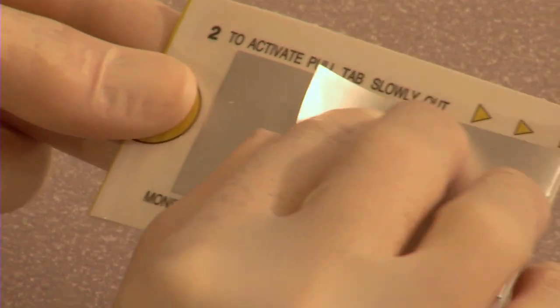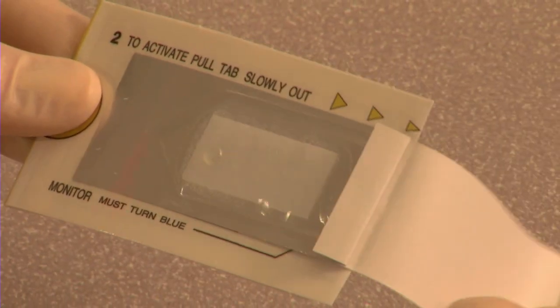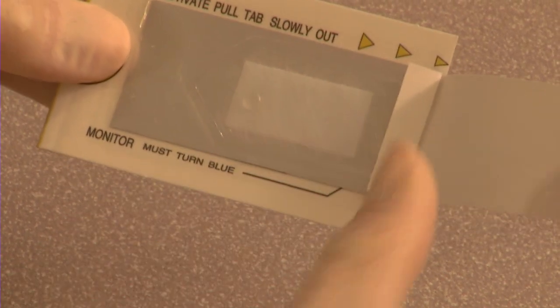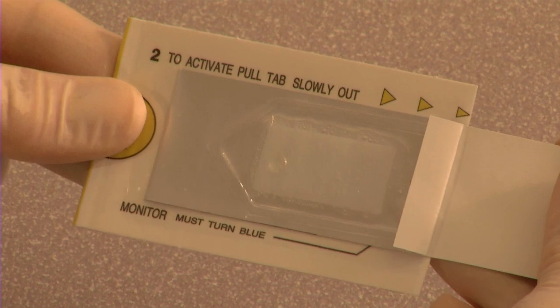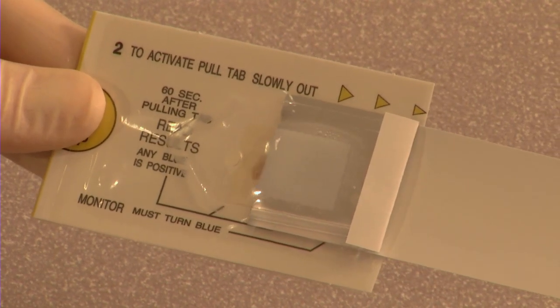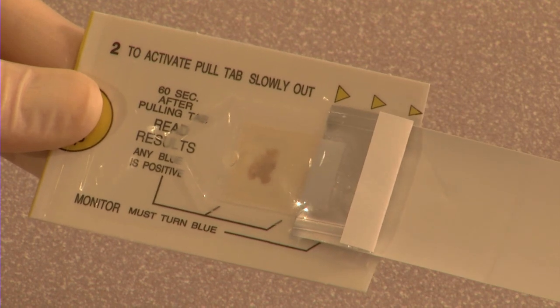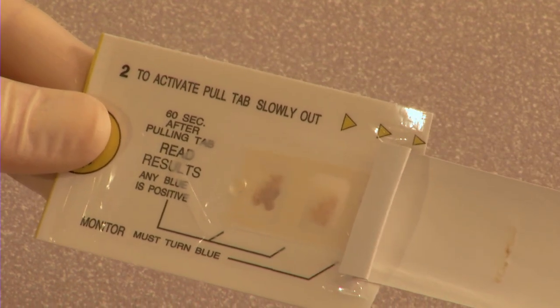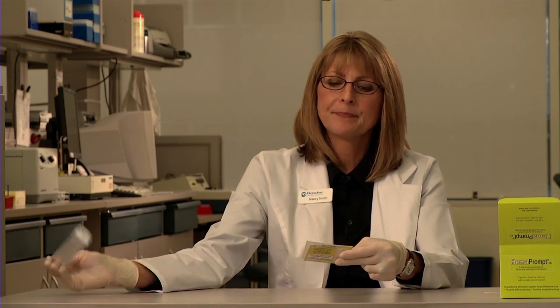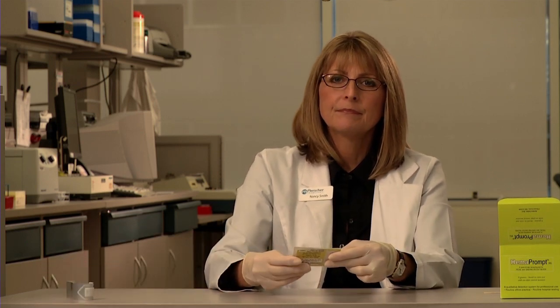Lift up the silver tab. When you do so, you'll see the developer pad underneath. Pull the silver tab all the way to the right, slowly. As you pull it, the developer pad will flip over and apply developer to the sample. Completely remove the silver tab. After 60 seconds, interpret results.